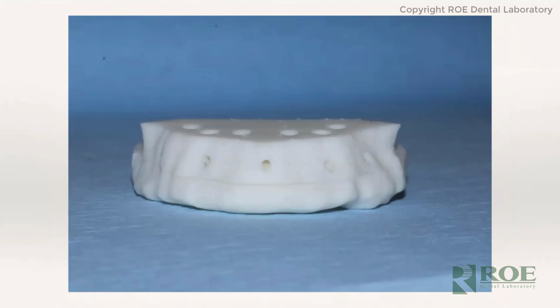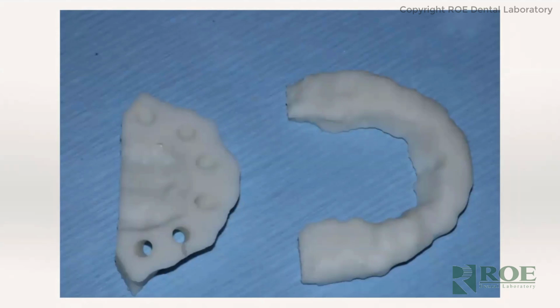I love to see this model and see how much bone is going to be reduced, and they have this available for me to take a look at how far back I'm going to need to take that bone reduction when we're doing a case like this.